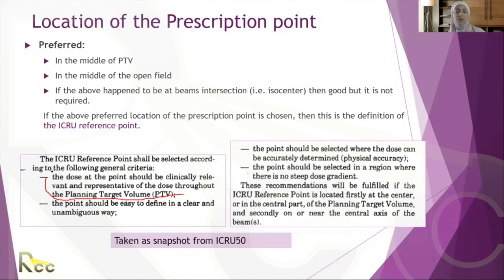Please stay away from the edges. Now, it doesn't matter if it's half beam blocked, because again, you look at the open beam. So follow the recommendation of ICRU of where to put your prescription point. If the isocenter happens to be in the middle, okay, so be it. We prescribe to isocenter, but remove the isocenter concept from 3D planning.